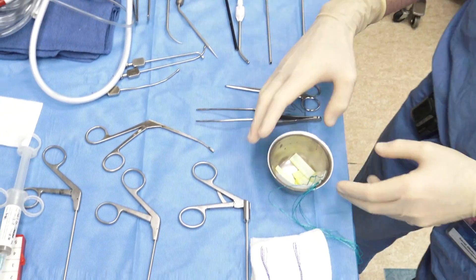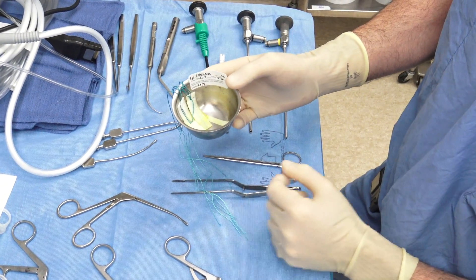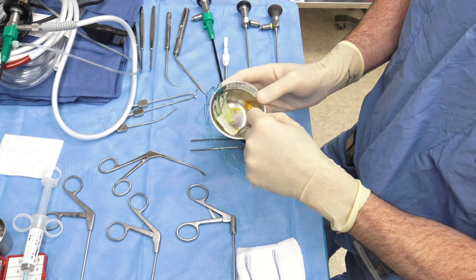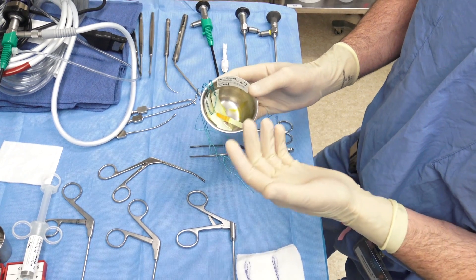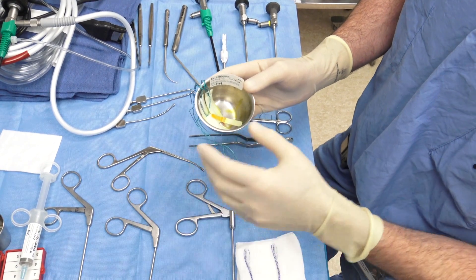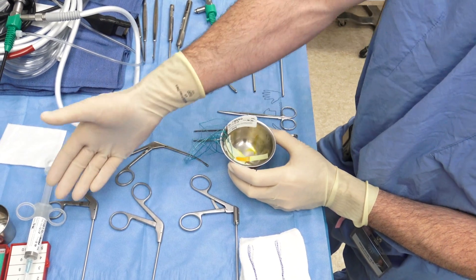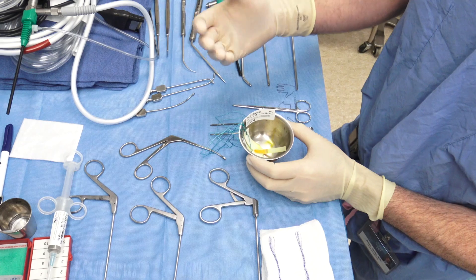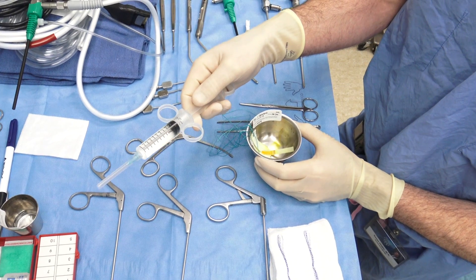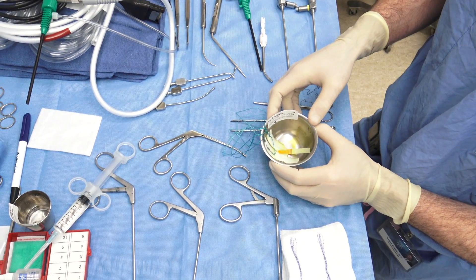The next thing is our topical decongestant. I use 1-to-1000 epinephrine, placed on pledgets. We do some injection on the table, though I don't typically inject very often. These are marked with a fluorescein strip to ensure the 1-to-1000 epinephrine is not accidentally drawn up and injected in the patient — because injecting 1-to-1000 epinephrine can cause significant cardiac issues. Our usual injection is 1% lidocaine with 1-to-100,000 epinephrine. If you're handed a syringe with green or yellow dye, that's your cue it's not your local — it's the 1-to-1000 epinephrine, which you do not want to inject. They're dyed for safety reasons.